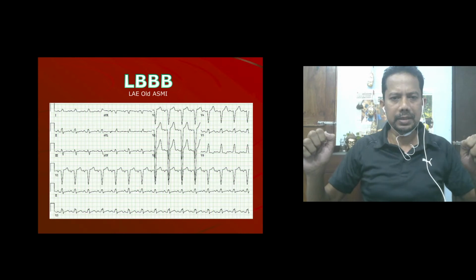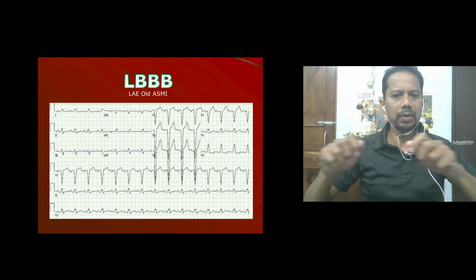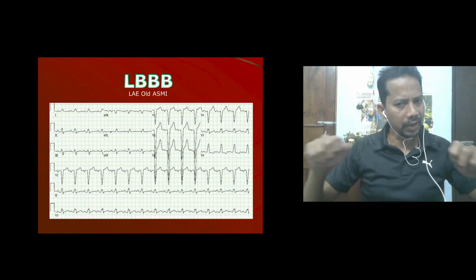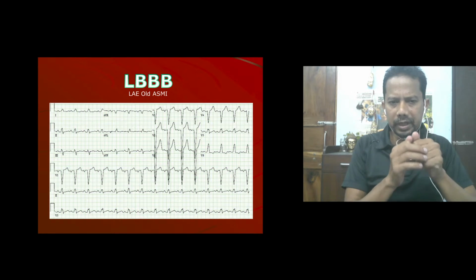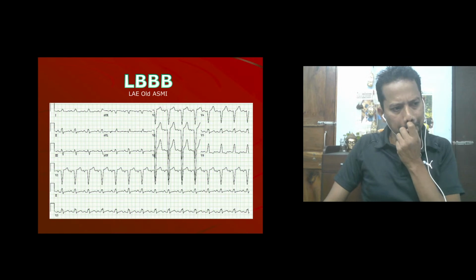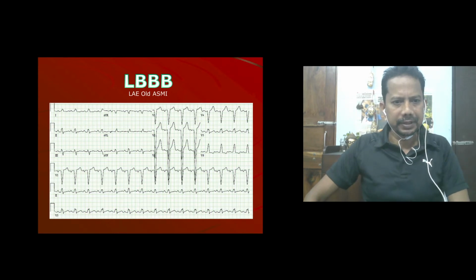By then, my brain has registered and calculated the heart rate and the axis, like lead 1, 2, 3, AVR, AVL, AVF. Then I look at the Q waves, the VAT, progression of the R waves, and the transition zones. Okay. So, like that you have to program your mind when you hold the ECG rhythm in your hand. So, Dileshwar says there is tall R in V5, V6.